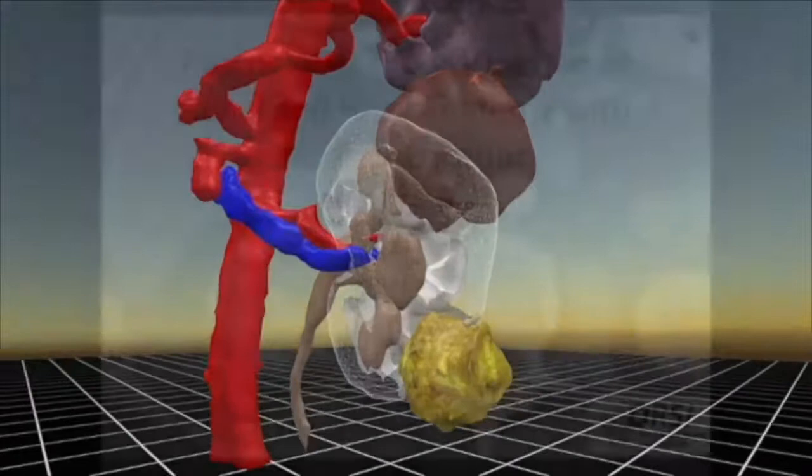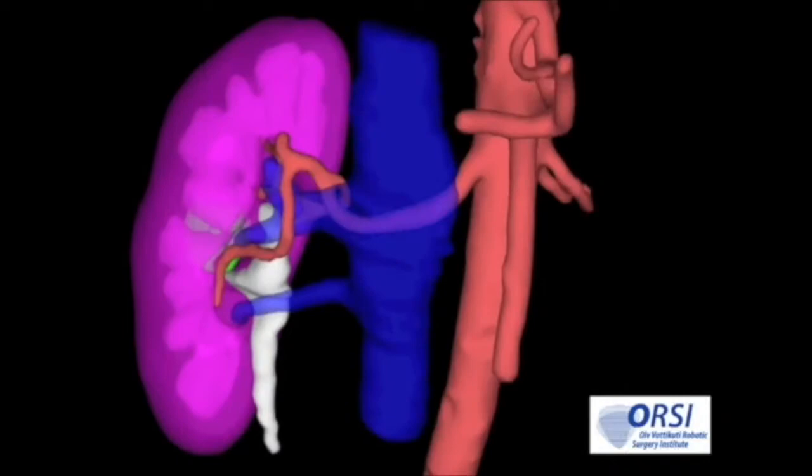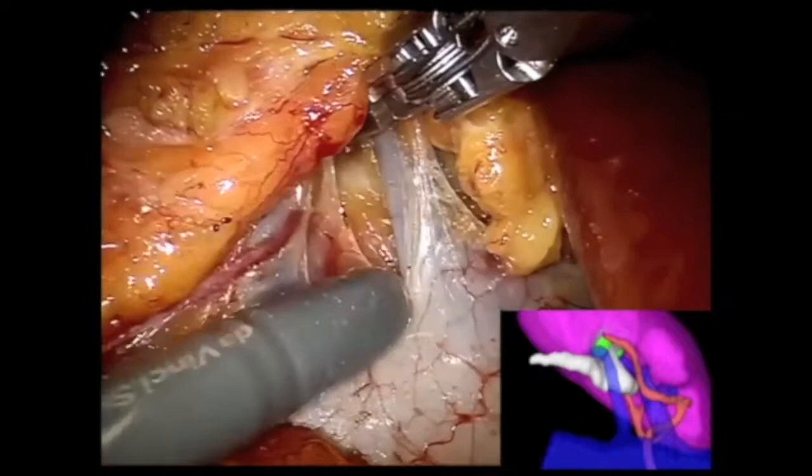To improve tumor localization and assist with planning of excision, 3D digital reconstruction provides accurate information regarding tumor location and vascular anatomy. The renal hilum is isolated using the 3D model to predict vessel location and guide dissection. Note there are two veins surrounding the main renal artery, corresponding to the 3D model.